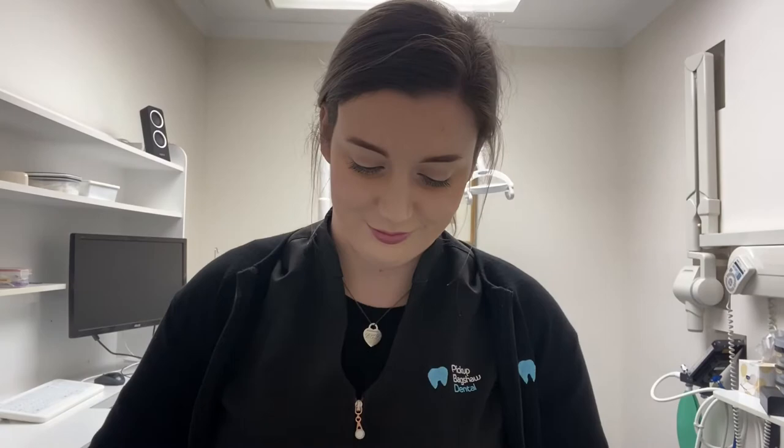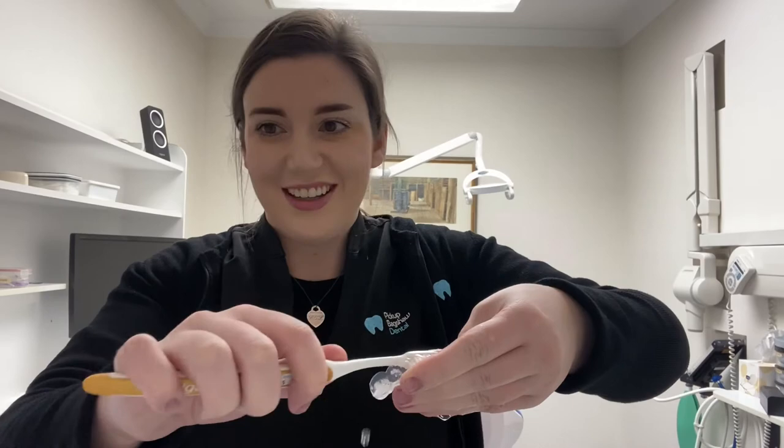My teeth now feel free of any excess whitening gel. What I'm going to do now with my whitening trays is grab the same toothbrush and clean off the trays of any excess residue. They are still a little bit wet but they're clean and free of all the residue. I'm going to put them back in my personalized Pickup Bagshaw Dental case.